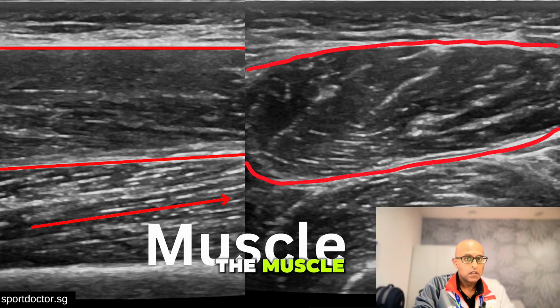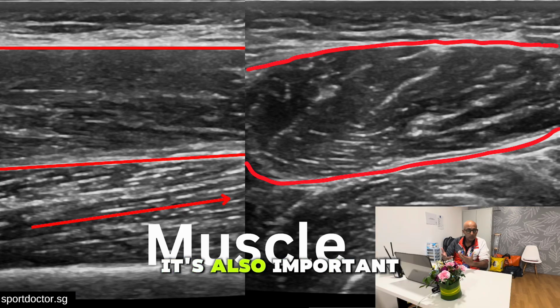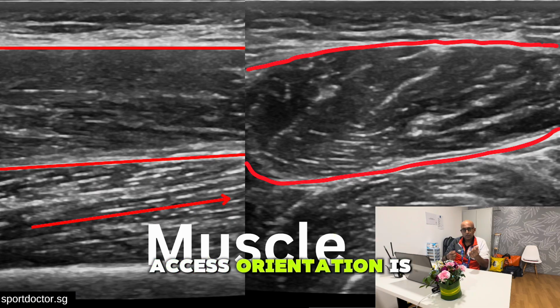When assessing the muscle, we're looking for the overall integrity, we're looking for the thickness of the muscle, we're looking for the fascial planes in between and the fascicles of the muscle to make sure that they're going continuously in one direction. It's also important to have a look at the muscle in a short axis orientation. Sometimes the short axis orientation is actually very valuable for looking for tears.